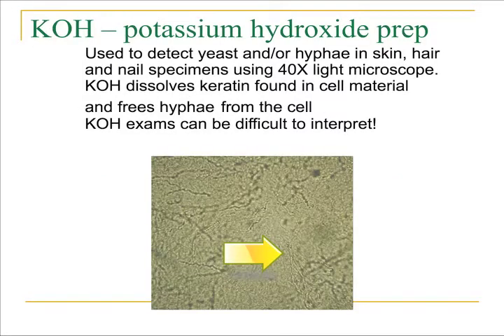On the next slide, we break down the KOH prep, or potassium hydroxide prep. This is a very old method that's been used for decades in the mycology laboratories, but more and more labs are trying to phase out the KOH, as you'll see.